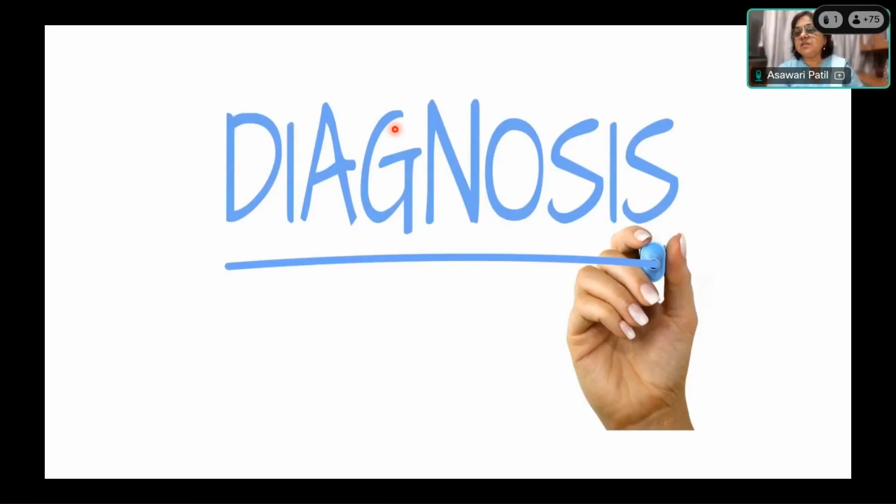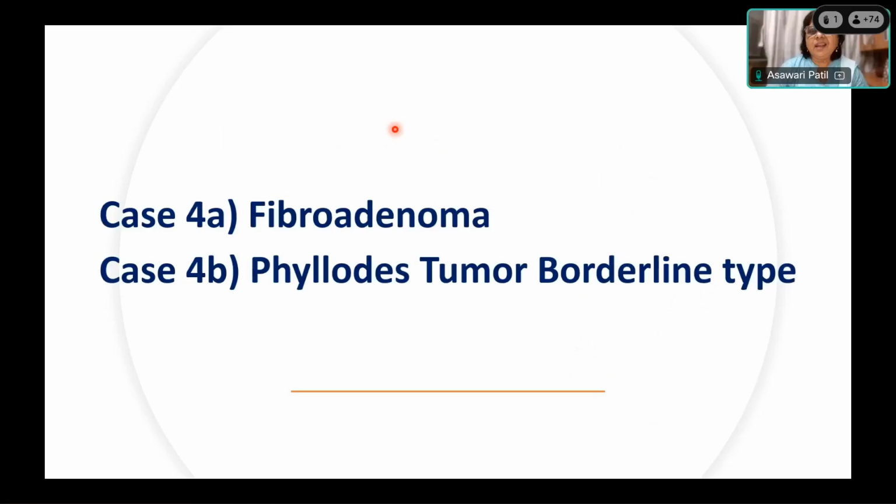Dr. Lira says it's at least borderline. So tell me, all residents, what do you think? Phyllodes tumor, what type of phyllodes tumor do you think this is? Borderline versus malignant, given the history. You can't decide. Anybody wants to call benign? Less likely. 4 months. We would say at least borderline.